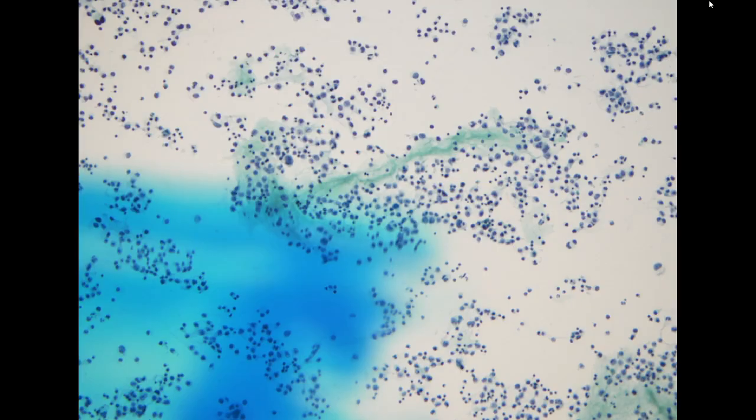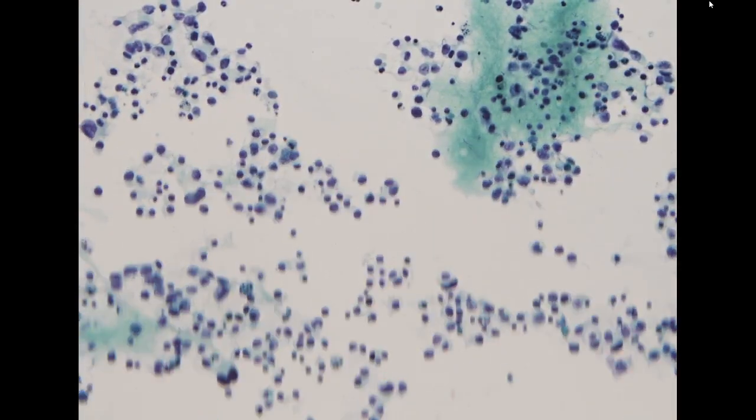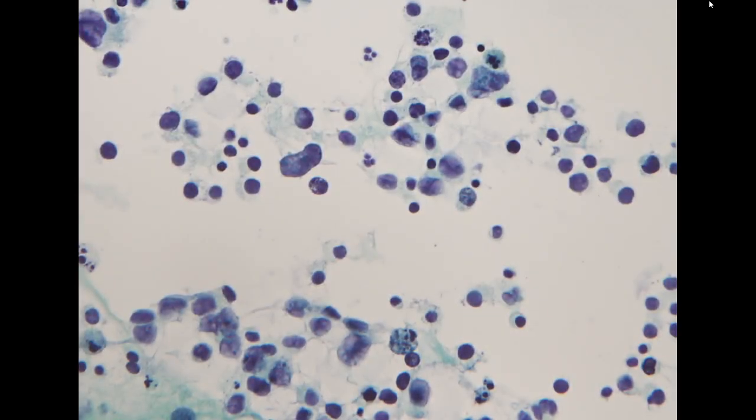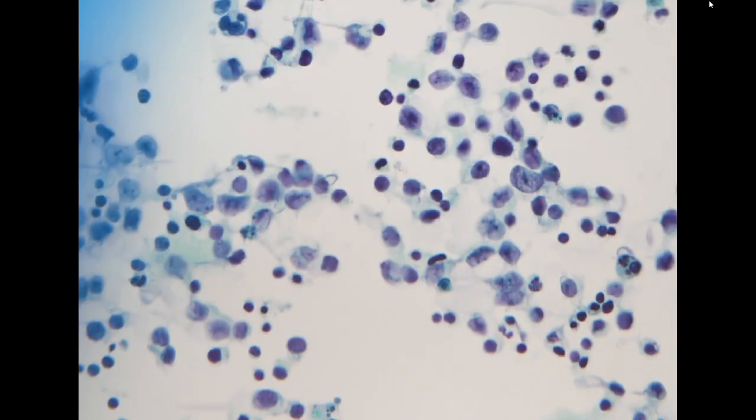For recurrence of disease, sometimes you can see the cells can still form glands. In this specimen, the cells are very, very loosely cohesive and very poorly differentiated. The patient also had a history of lung adenocarcinoma, but in this case, it seems to be very, very poorly differentiated. So this is positive for adenocarcinoma, poorly differentiated.